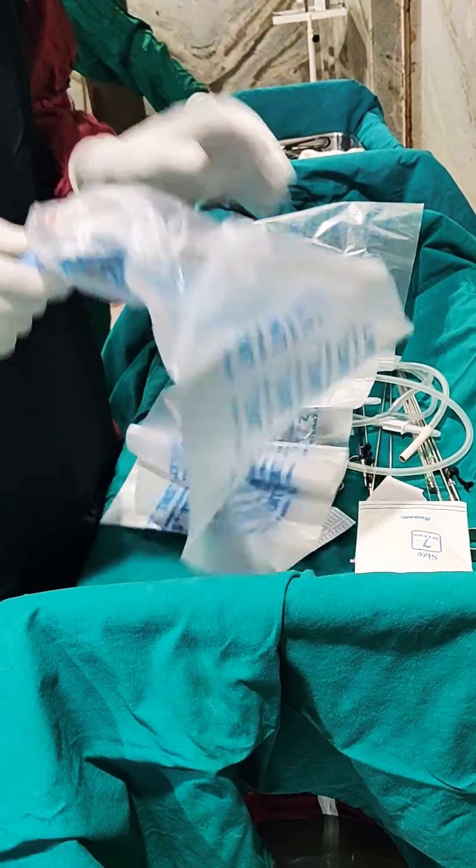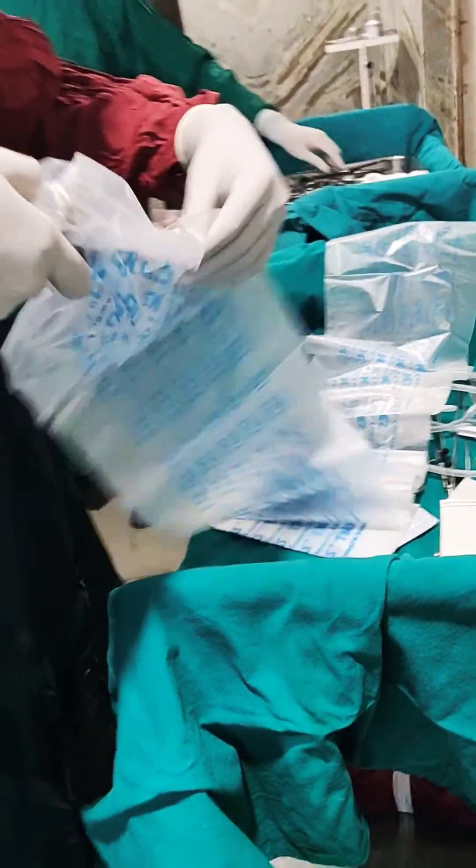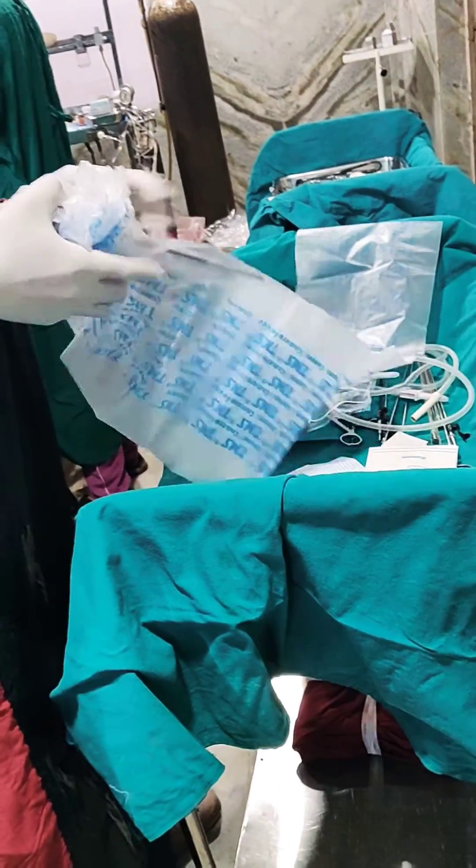This is the first step. Now I have to put my endoscope through the entire plastic sheet.